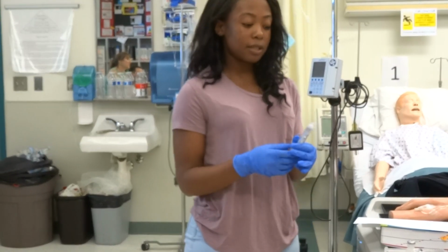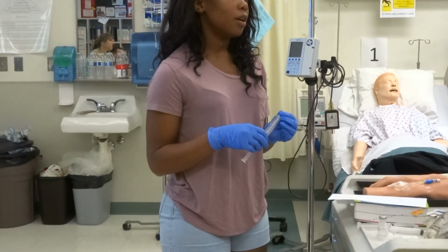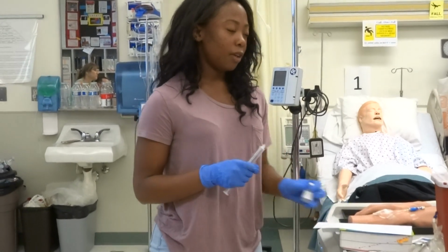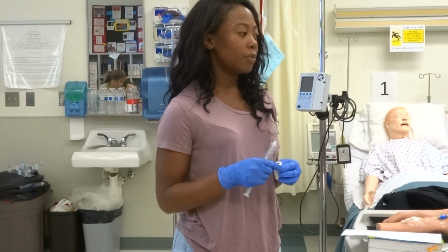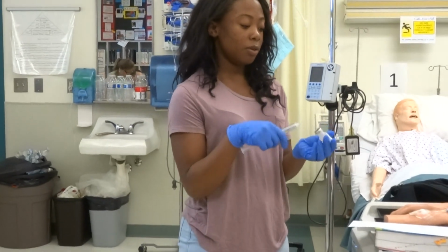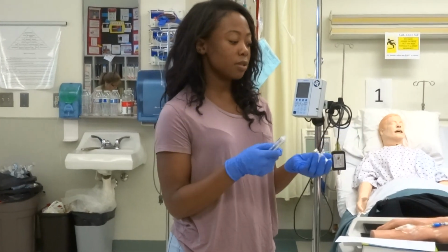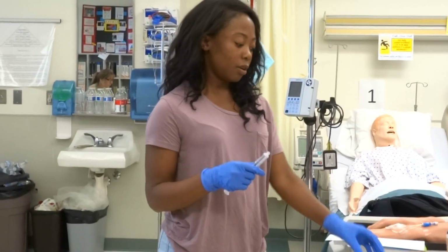Yeah, so the drug guide says to reconstitute with normal saline. So all you do is get like an 18 gauge needle, which is, by the way, one of the bigger needles. And the purpose of that is that if you even try to use like a 20 or anything smaller than that, it's gonna bend. They literally bend in there. You know, little insulin syringes, how they just bend really easily. When you puncture it to try to pull your medication out, it's gonna bend and it's just gonna create a mess. So 18 gauge, you're gonna connect it to this right here, and then.